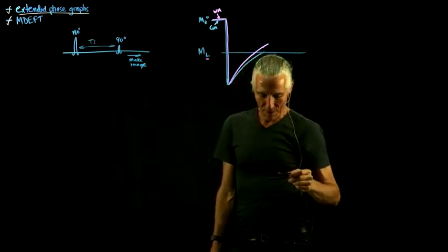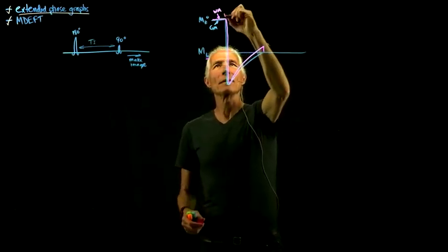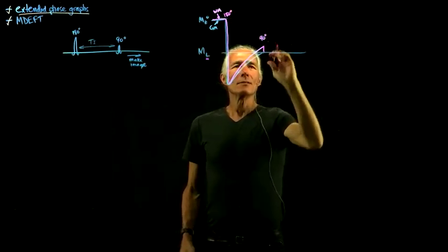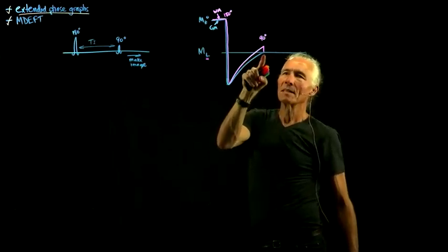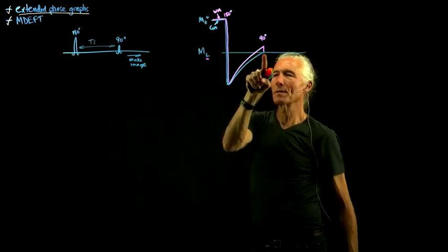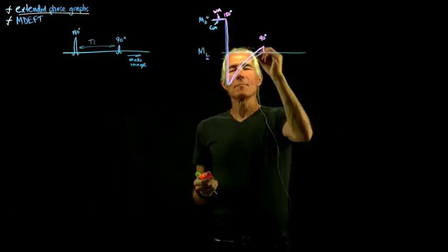then if you do a flip at this point, a 90-degree flip, so this was the 180 here, and now you do a 90, you should get really good contrast between those tissue types, because you should get no signal. There's no longitudinal magnetization for the gray matter, and there's a small amount for the white matter, something a lot bigger than 0.